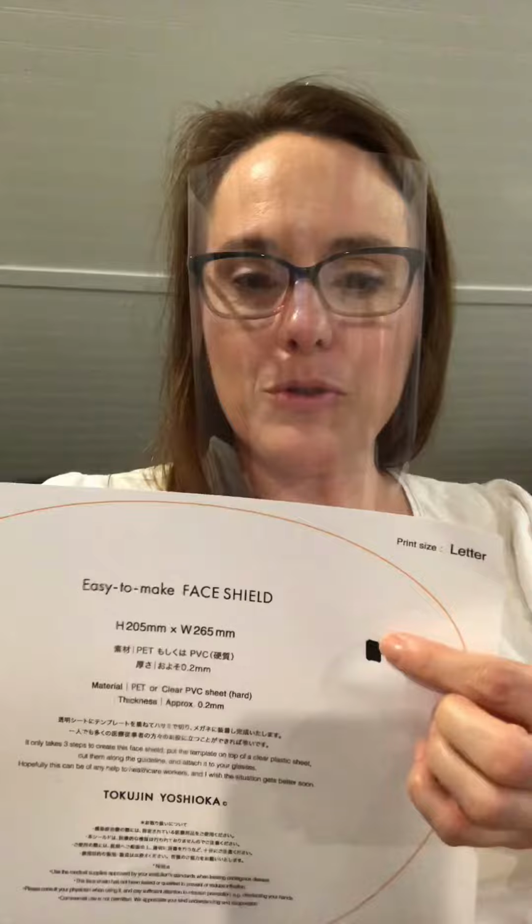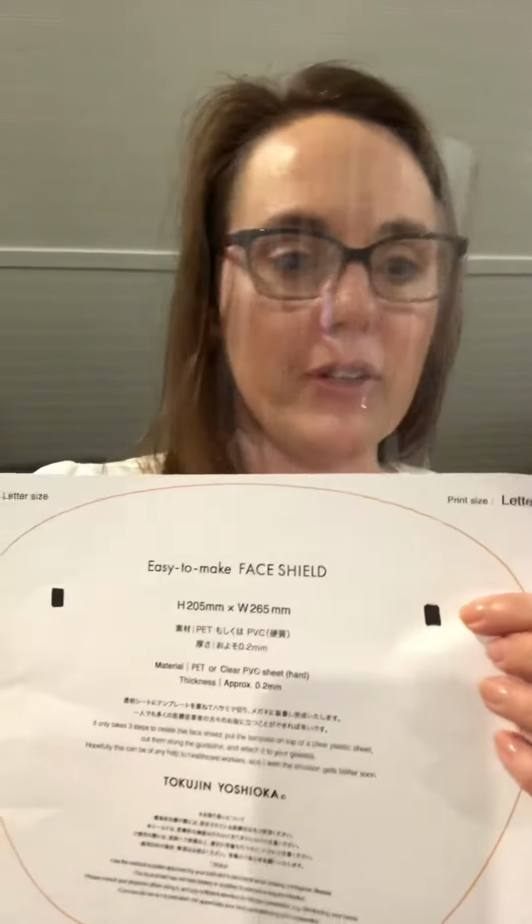The one thing I want to show you is here's my printed pattern. And I drew squares over, let me see if I have a smaller size, I'll show you. I'm going to take this off so you can hear me. I drew squares over the little curves, and so the original pattern, these are the kid sizes, has little curves there. I found if I just cut a curve in the acetate, my glasses cracked it and it didn't go through smoothly. And so I drew these little squares, and then I cut them out with an X-Acto knife from Dollar Tree. So no big deal.